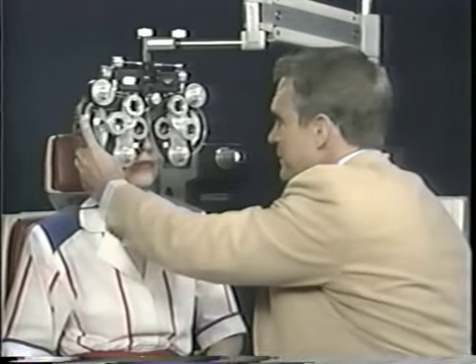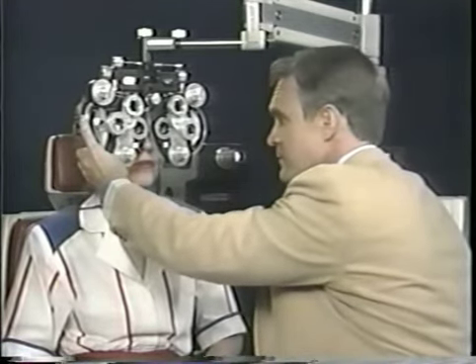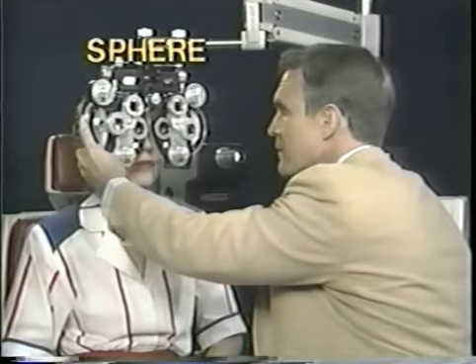Now read the smallest line you can see on the chart. A, P, S, O, T, F. Good. Now watch closely. I'm going to change it. Does this make it better or worse? Ready? Sphere will be adjusted first for best visual acuity.